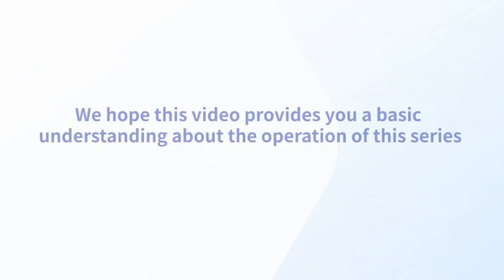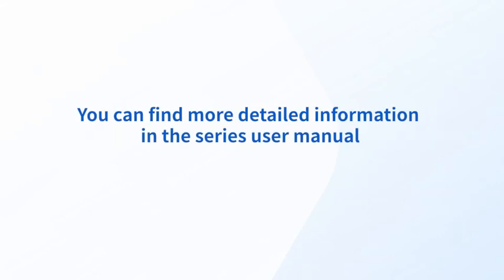We hope this video provides you a basic understanding of the operation of this series. You can find more detailed information in the series user manual.